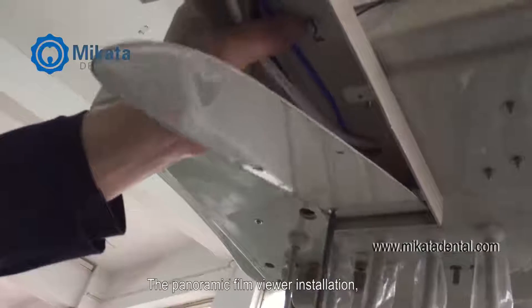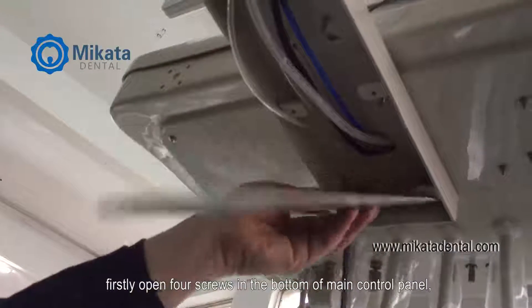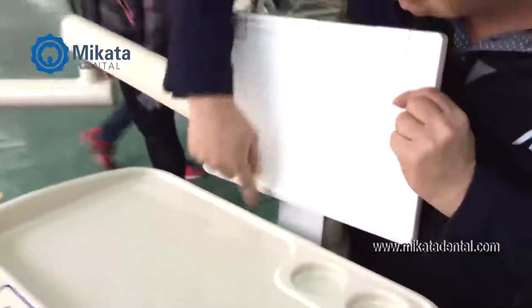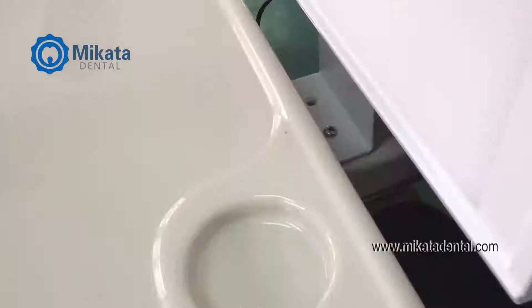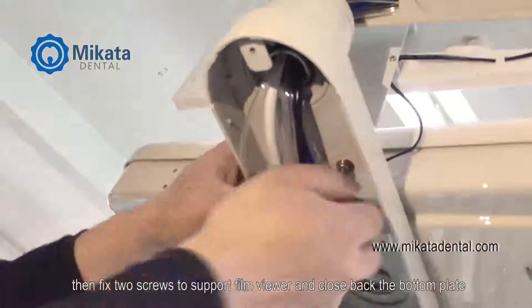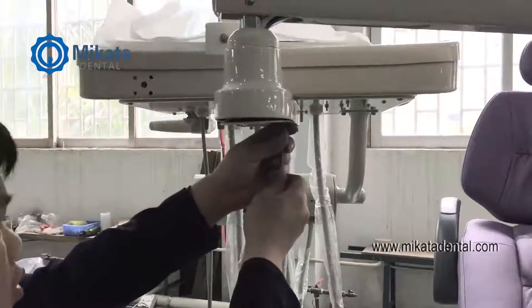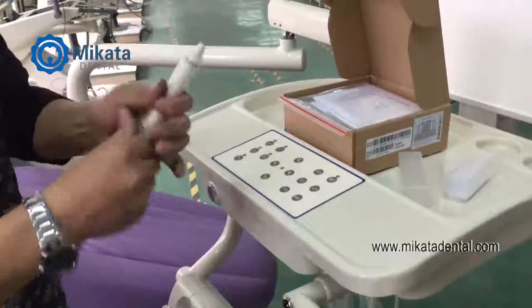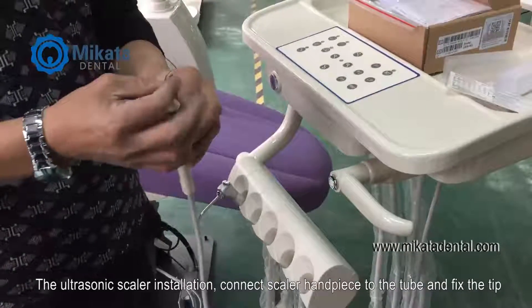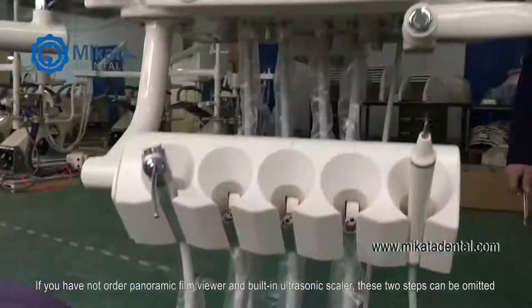Panoramic film viewer installation. First, open four screws on the bottom of the main control panel. Then fix two screws to support the film viewer and close back the bottom plate. Ultrasonic scaler installation: connect the scaler handpiece to the tube and fix the tip. If you have not ordered the panoramic film viewer or built-in ultrasonic scaler, these two steps can be omitted.